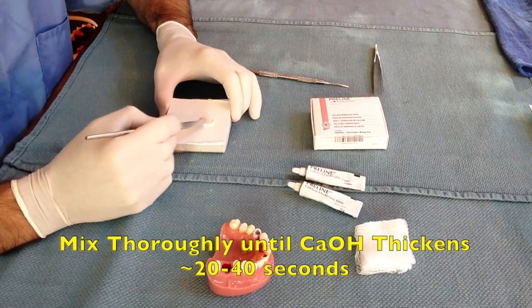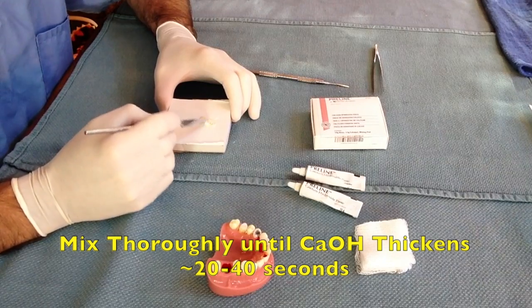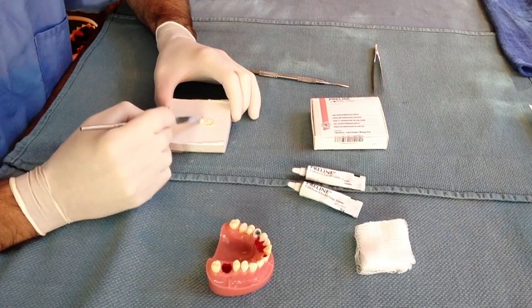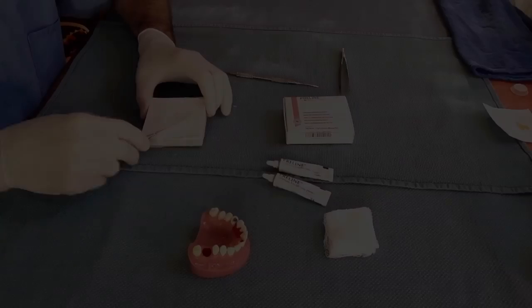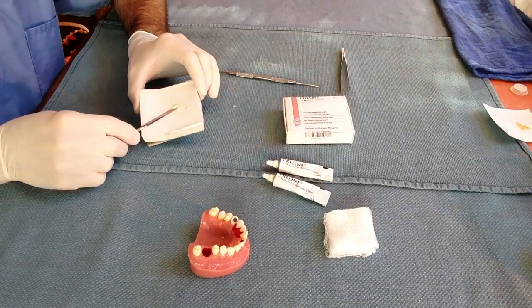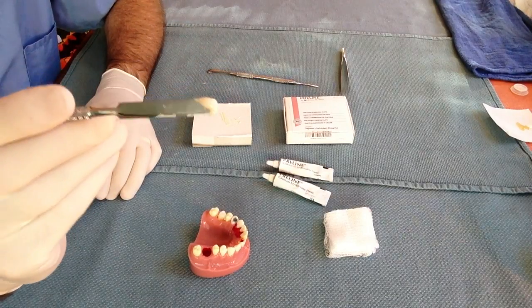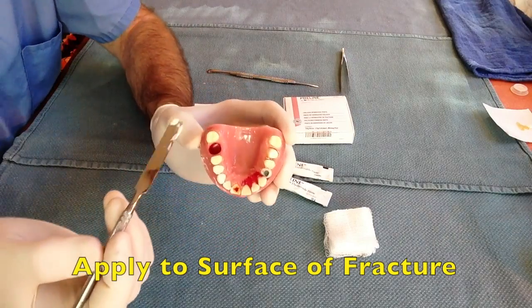Using the stainless steel mixing spatula, mix the catalyst and the base thoroughly until the mixture begins to thicken. This usually takes about 20 to 40 seconds. When the calcium hydroxide thickens up, scoop it up onto the flat blade of your spatula. Apply it to the fractured surface of the tooth, making sure all of the exposed dentin and pulp are covered.